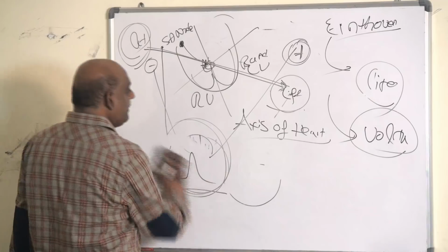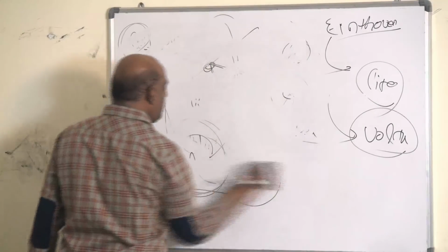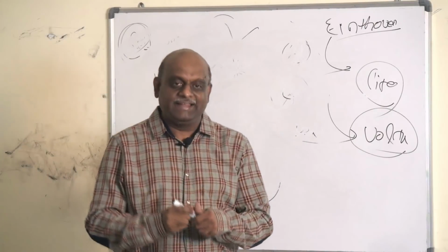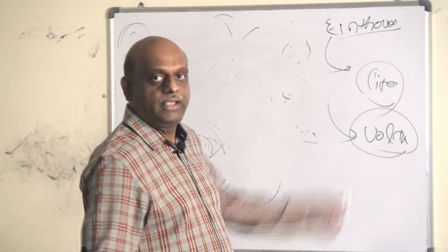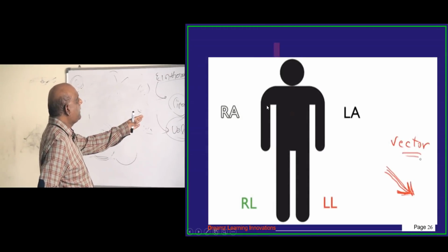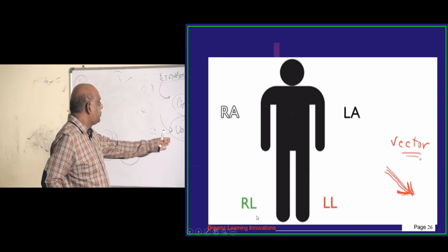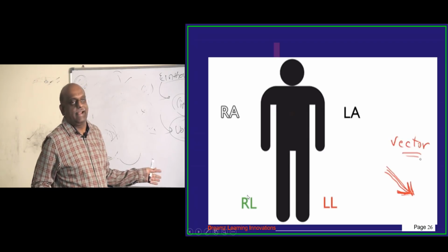So, Einthoven went to his father-in-law. He said, "Oh my darling father-in-law, show me your right hand. So, can you give me the slide? Show me your left arm, show me your right arm, show me your left leg." Very good. So, he put the right leg earthed. He made earthing to the right leg.